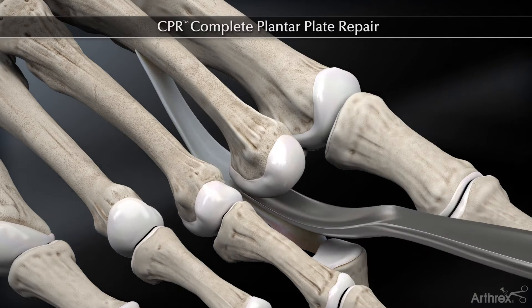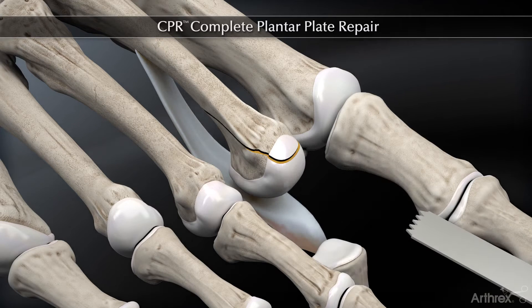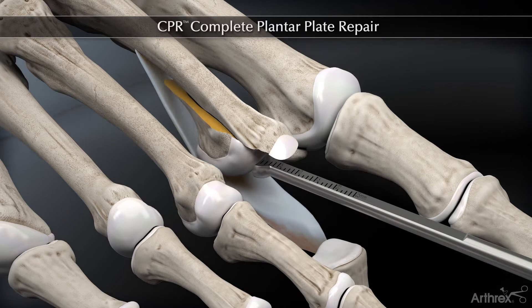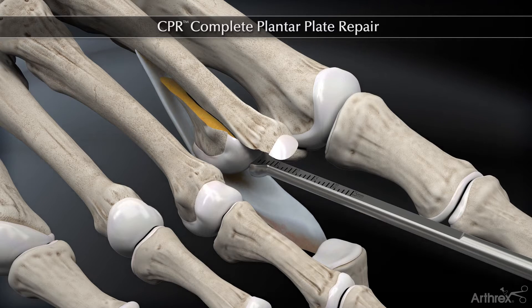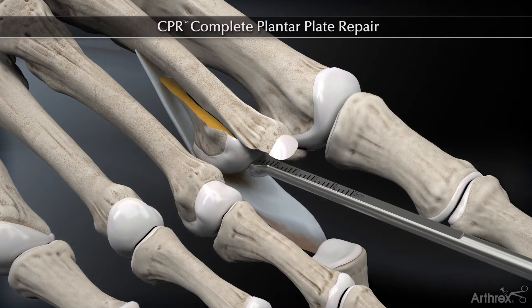The McGlamrey elevator is used to release the proximal capsule, and then this allows our Weil osteotomy to be translated in a proximal direction, which actually brings the plate a little more accessible by bringing it down into the MTP joint space itself.